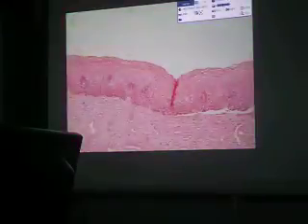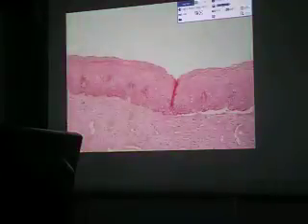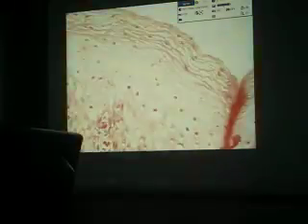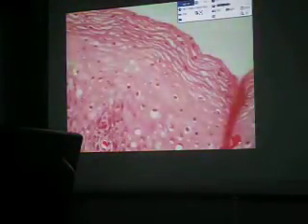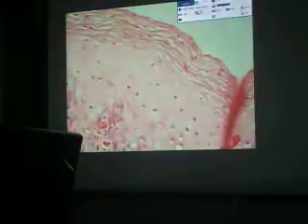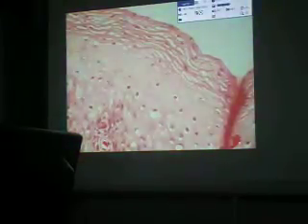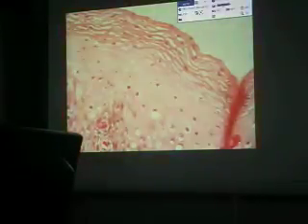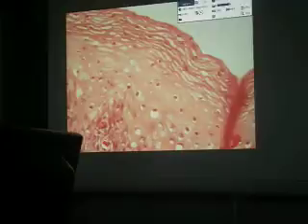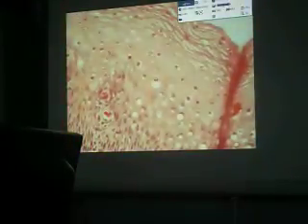How will you now call the nuclei which are already small in size? What is the microscopic description of a nucleus that has decreased in size? Karyorrhexis, karyolysis, or pycnosis? Okay, so there is pycnosis of the nucleus, and you have already discussed this in the lecture.